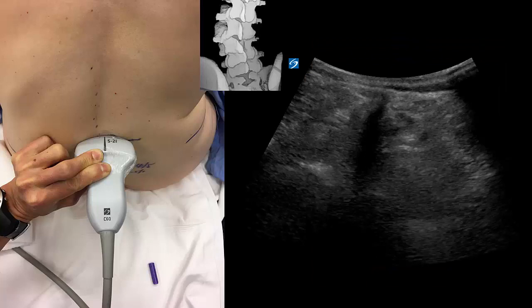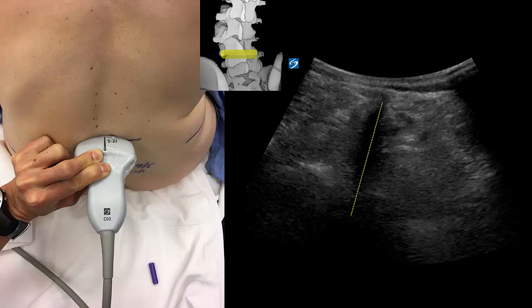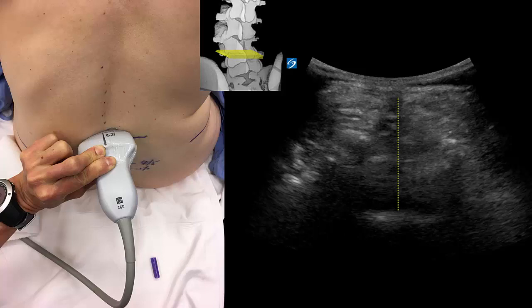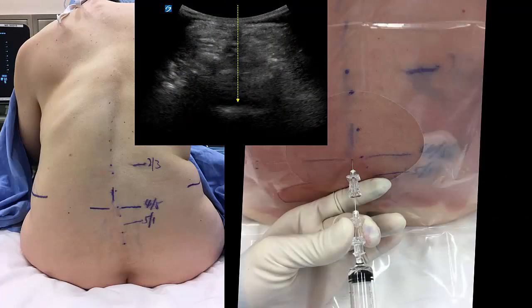This is the transverse view at the L2-3 level, with the probe perpendicular to the surface of the back. The spinous process shadow is clearly tilted, with the body rotating towards the left, or the convex side of the curve, and the spinous process rotated towards the right and the concave side of the curve. Rocking the probe to tilt it towards the left shoulder brings the neuraxial midline into the vertical. An interspinous view has also been obtained with the anterior complex clearly visible, indicating an open midline window at this level. Note the angle of the probe, which indicates the angle of needle insertion at this level with a midline approach. At the end of the day, however, we chose to go at the L4-5 level in this patient, as the space was wider and there was not as much rotation of the spine.